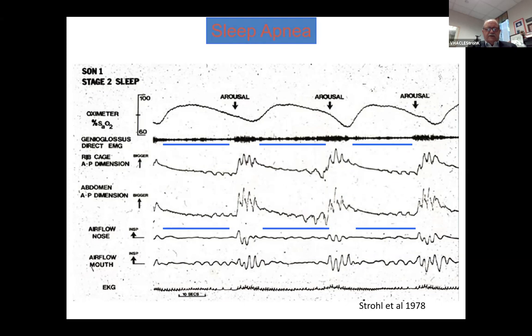Okay. So what you're seeing is that the start of the apnea started with probably a prolonged expiration and continued with a reduction in FRC until there was some resumption of efforts. And you can see those happening first in the genioglossal EMG with a burst of genioglossal EMG activity. But you start seeing these interesting little movements at the end, the last three. Which way are they going? Looks kind of paradoxical, so it looks like they're happening in opposite directions.